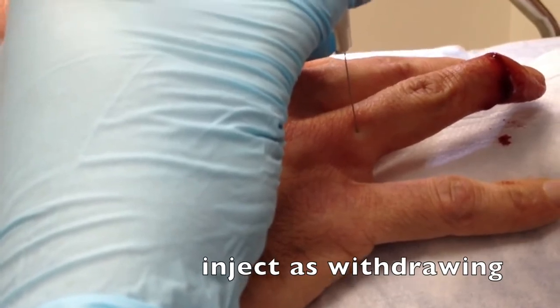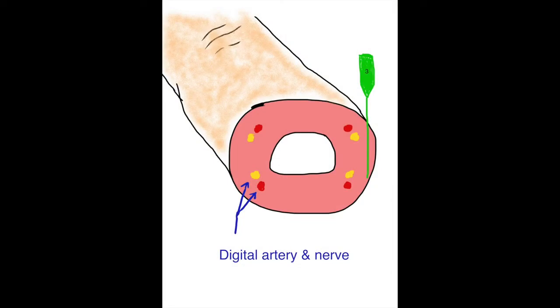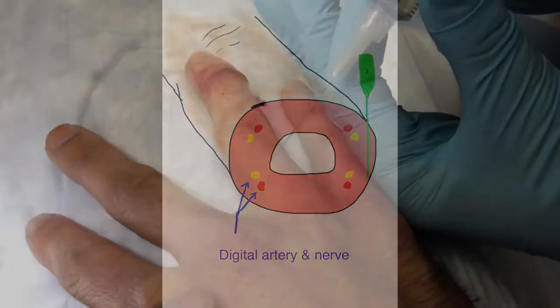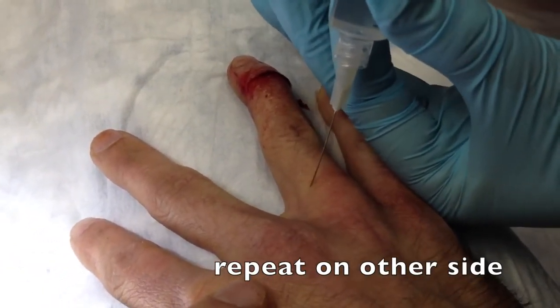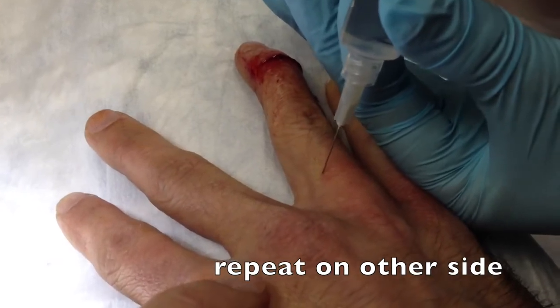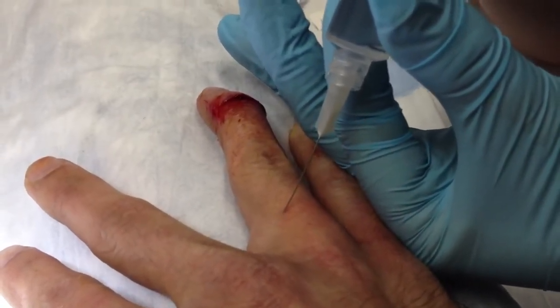At this point, I'll remove the needle and syringe from the finger and perform the third injection on the other side of the finger. This in theory is an area that's already been anesthetized, so this should be less painful for the patient. We'll repeat the technique, simply advancing the needle while aspirating and then injecting as we withdraw the needle.